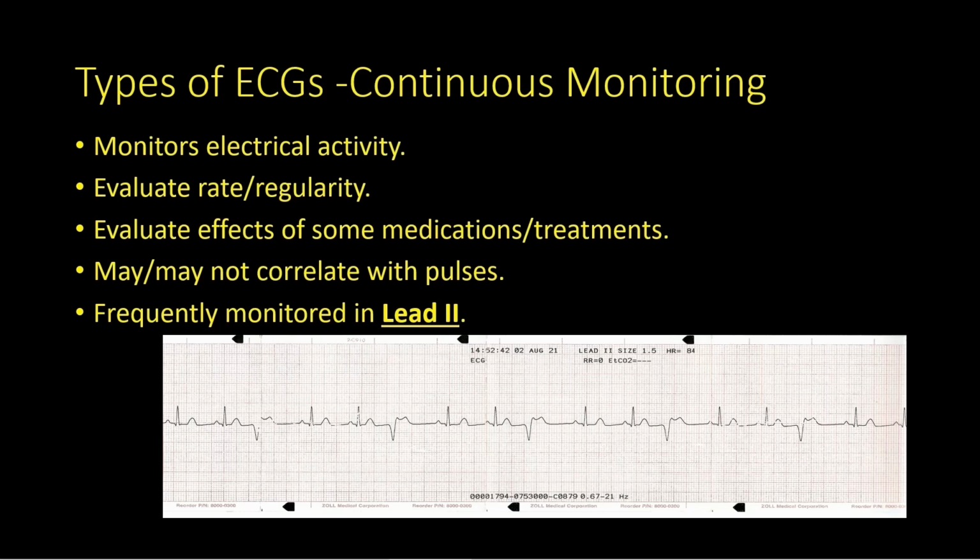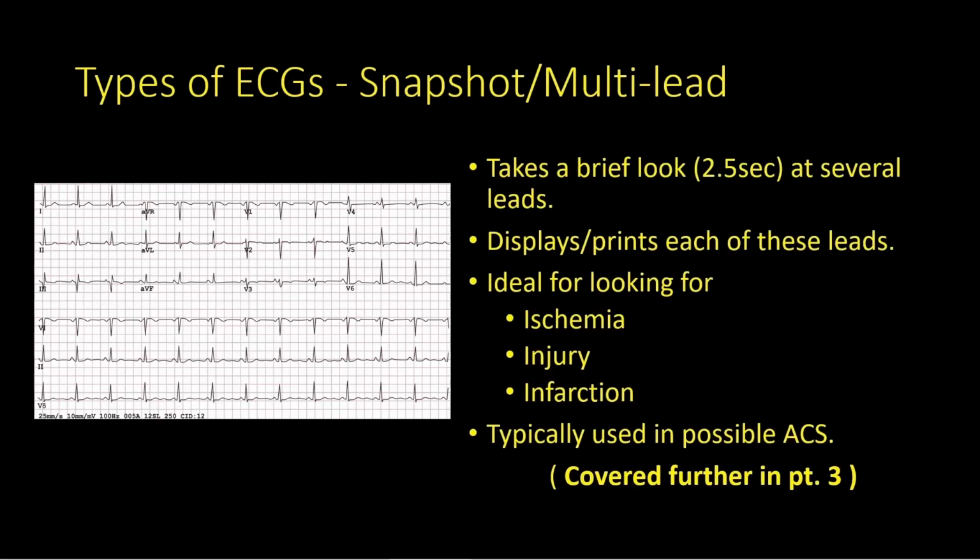Now, we frequently will monitor in the pre-hospital environment at lead 2. The reason we monitor lead 2, like I said before, is that it most closely resembles the path of electricity through the heart.